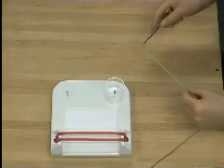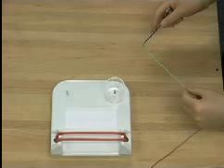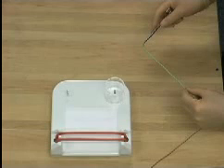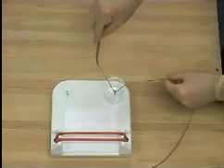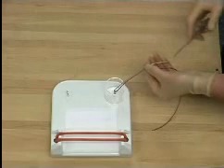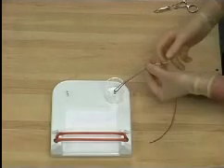The next task is to tie at depth, and with the ligature mounted on an artery or Robert's forceps coming out of the tip of that forceps, the structure to be tied is encircled. A forehand throw, as in the first knot, is created.